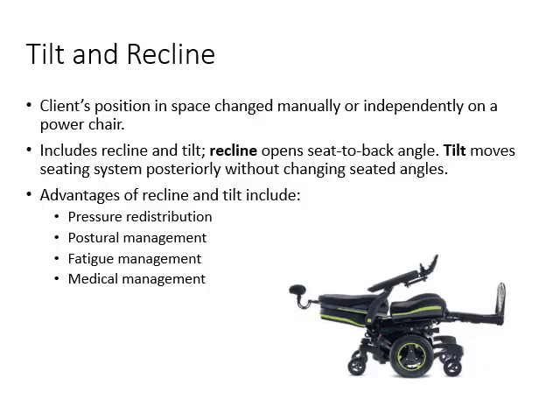Let's talk a little bit about tilt and recline functions of wheelchairs. It's really important that the client's position is changed either manually, independently, or in a power chair. There are manual chairs that have a tilt function, but that needs to be done by the attendant. Power chairs also have a tilt function, and that can be managed by the user themselves.